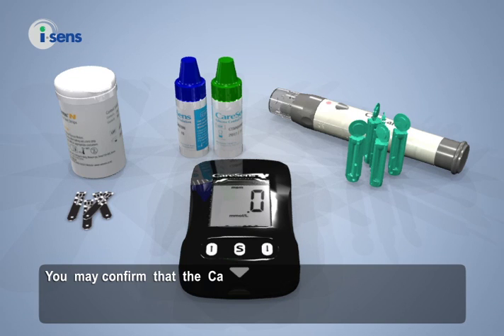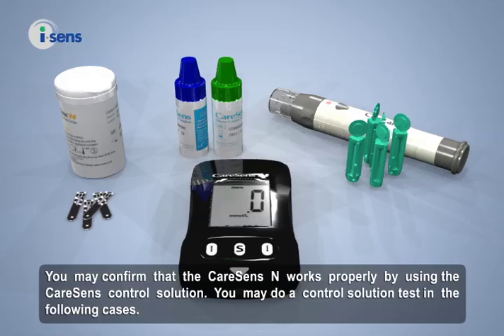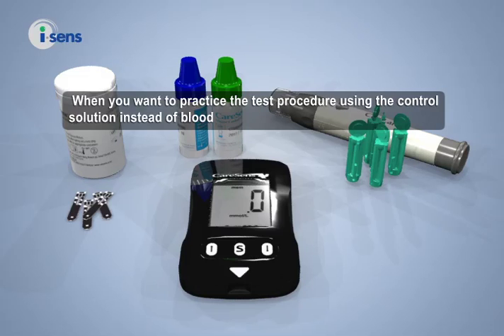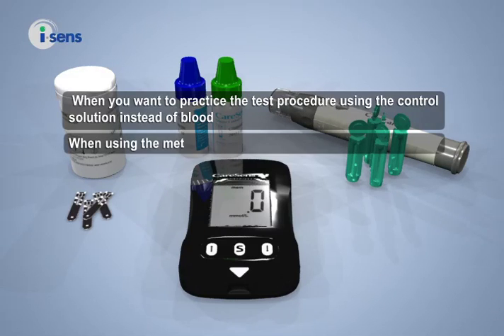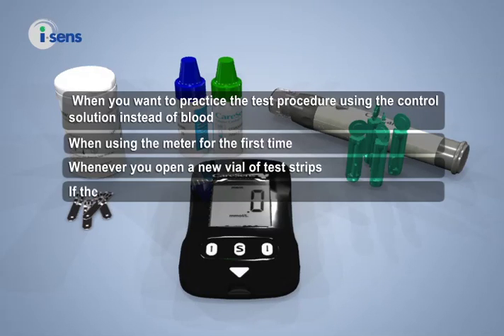You may confirm that the CareSense N works properly by using the CareSense control solution. You may do a control solution test in the following cases: when you want to practice the test procedure using the control solution instead of blood, when using the meter for the first time, or whenever you open a new vial of test strips.